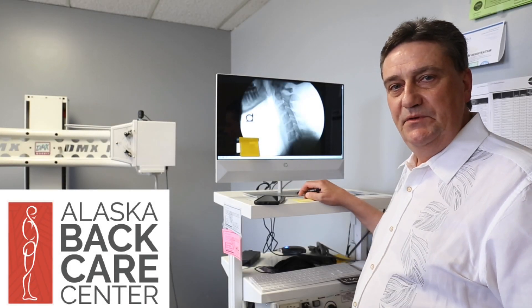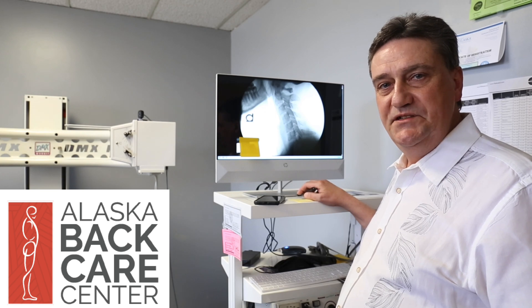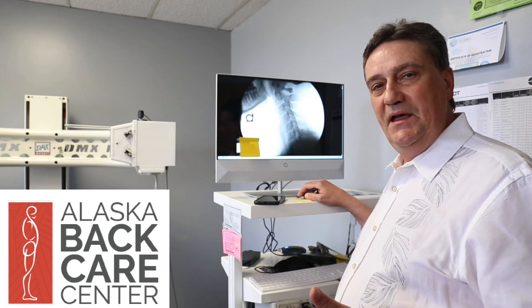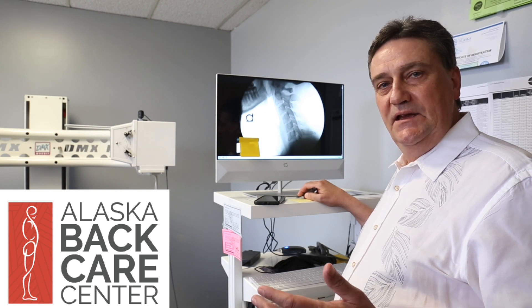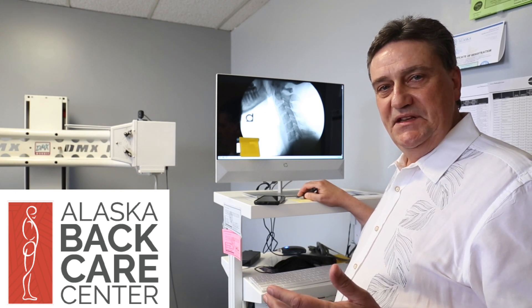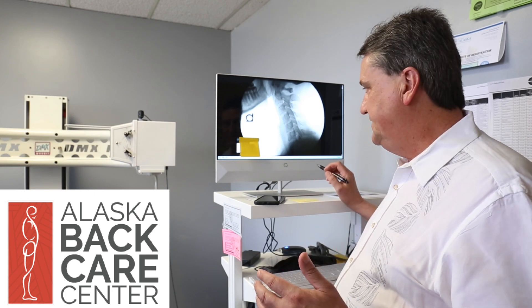This is a digital motion x-ray image of a real patient who suffers chronic pain from an old whiplash injury. Her MRI came back not showing much but a little bit of degeneration in the mid part of her neck. That didn't really explain all the symptoms and the chronic pain she's having, so we did this motion study.